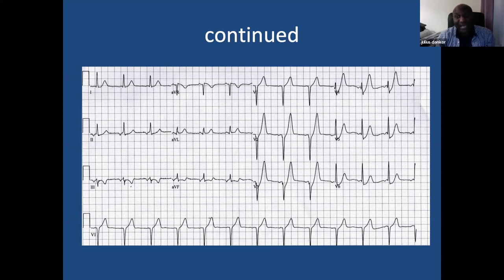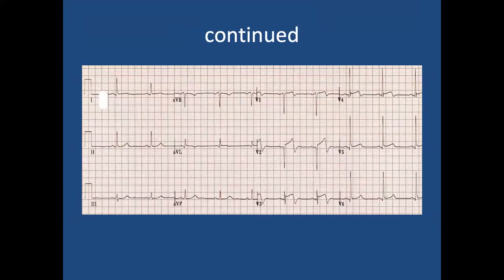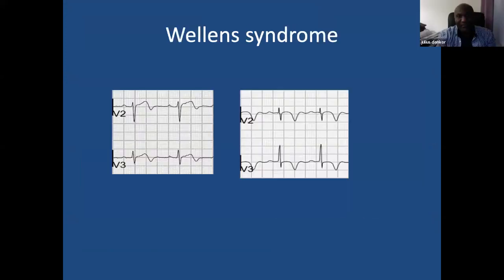That is an emergent MI that you need to act on, before it becomes full blown, like a proximal LAD occlusion, within hours. So a lot of people do miss that. That's a very good one. And Wellens syndrome as well.